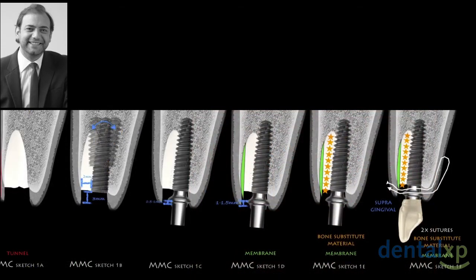Now, this is the concept. I will not go through it, but we will have these sketches online. This is something I would like to focus on. We always say palatal implant placement. It's actually the upper part of the implant, the upper third, which needs to be palatal. The inclination we can change, okay? So sometimes we place it palatal, but with the wrong inclination.